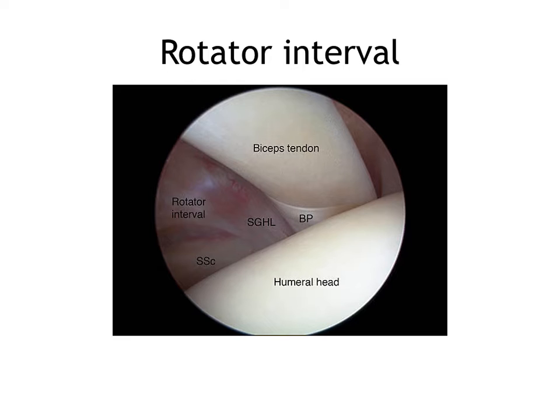Once you have established your posterior portal, you should first visualize the rotator interval. This should be a landmark that is first visualized before undertaking a diagnostic scope. At this point, many will create an anterior working portal so they can use a probe throughout the diagnostic scope.